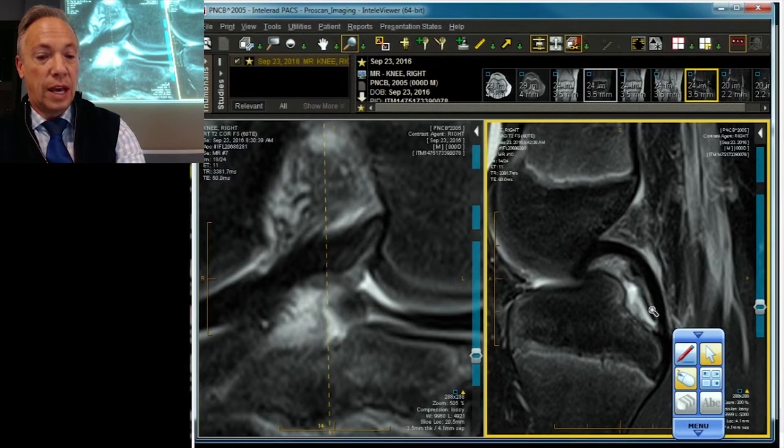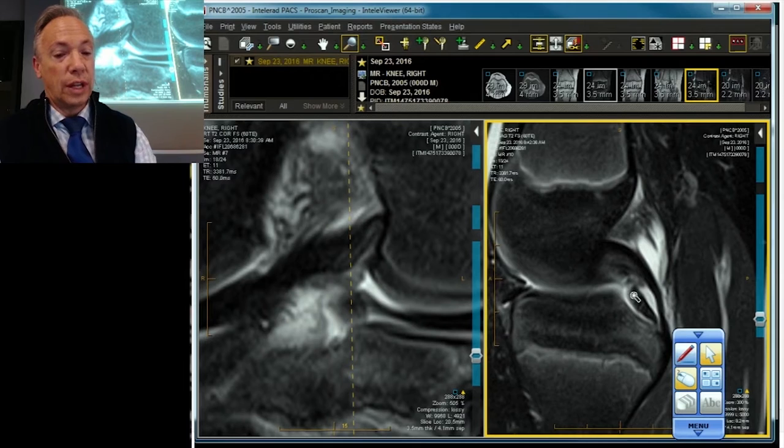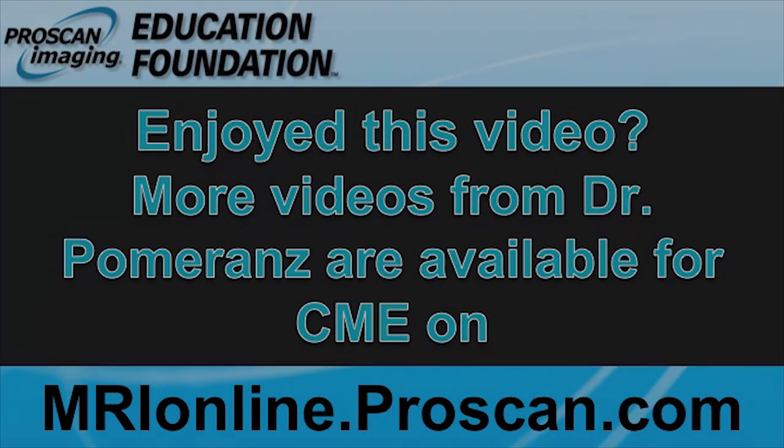Here's the medial side — it's not so flush, is it? That's the root ligament floating off of its normal tibial attachment surface. We go to the next cut. There's the interface between the ligament and the meniscus, and once again it is not flush on the surface of the tibia. It's a beauty.